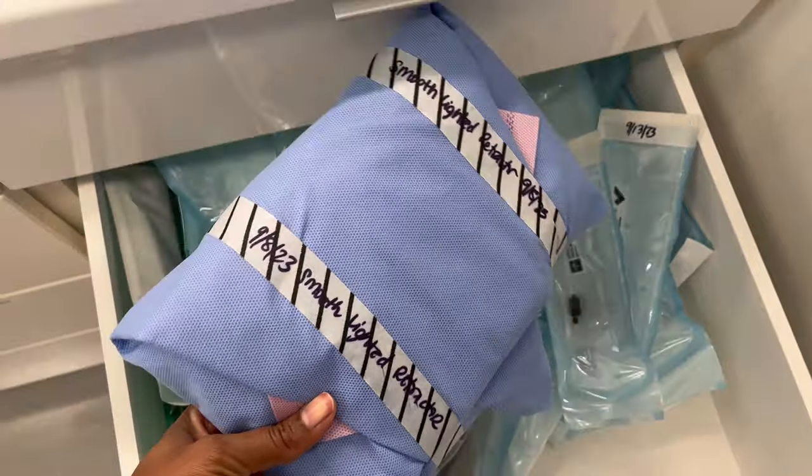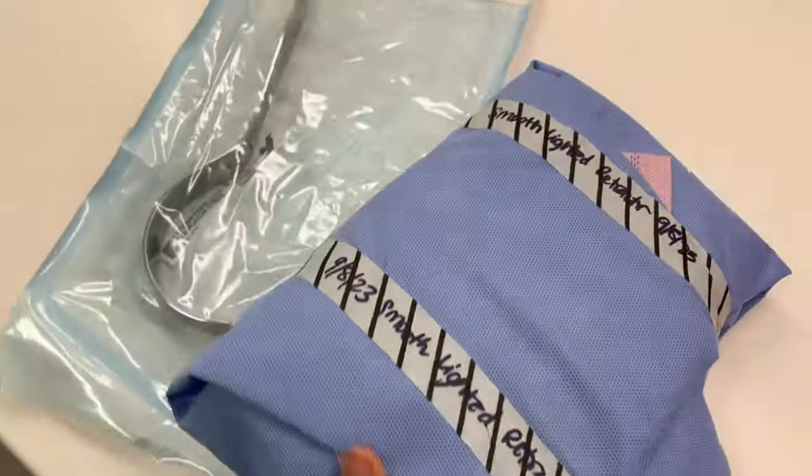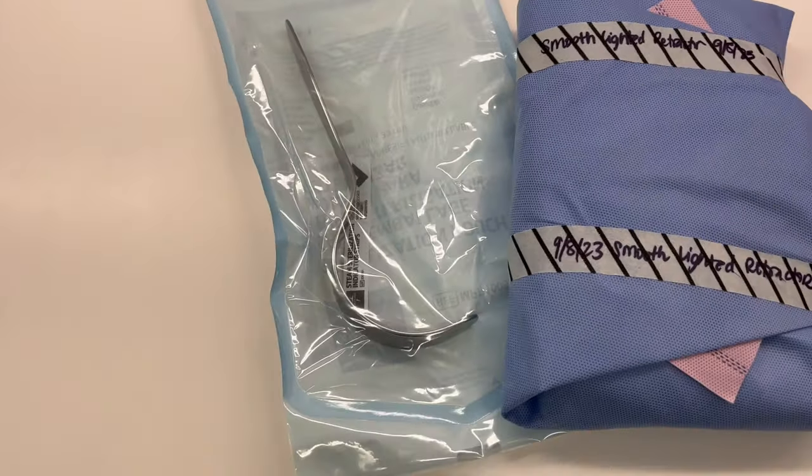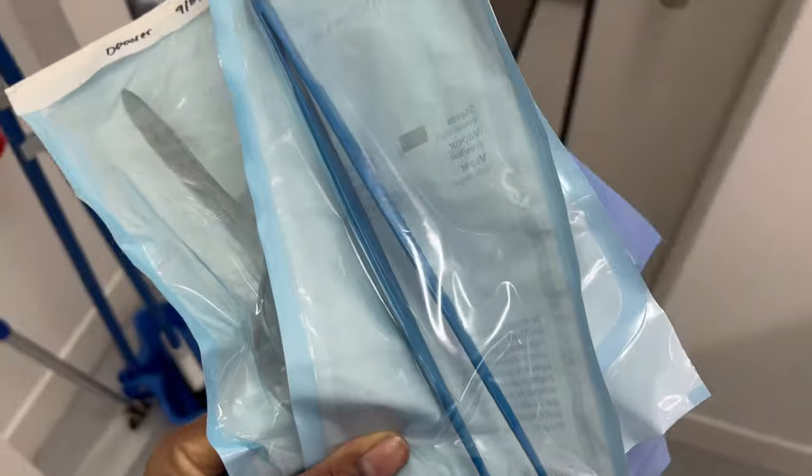So then I just go ahead and open a few more things that I was going to need for that case. I also grabbed an insulated DeBakey, which I didn't open because he didn't need it. Literally, you don't need the DeBakey.